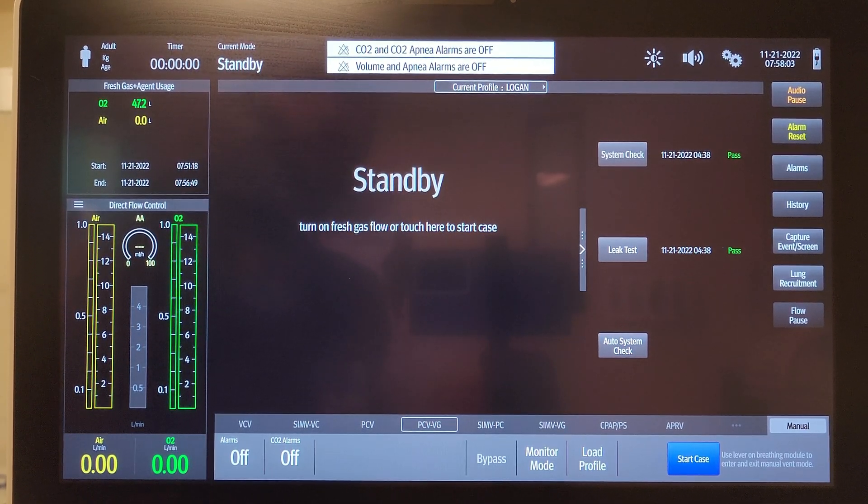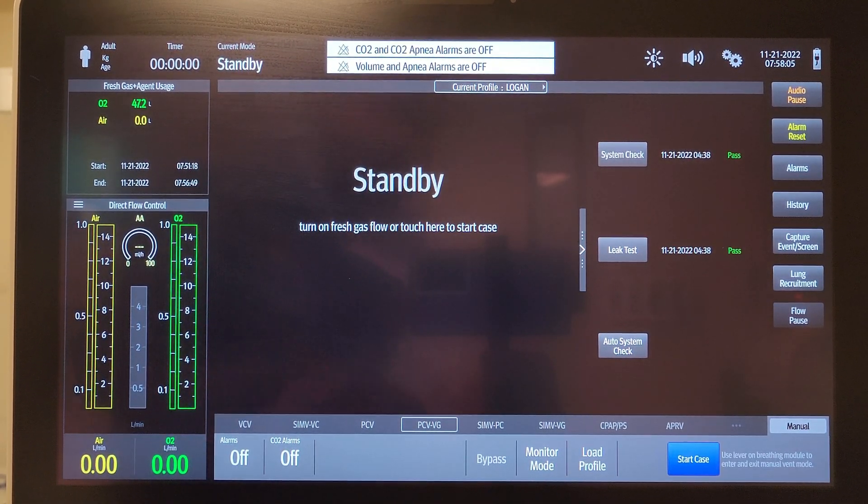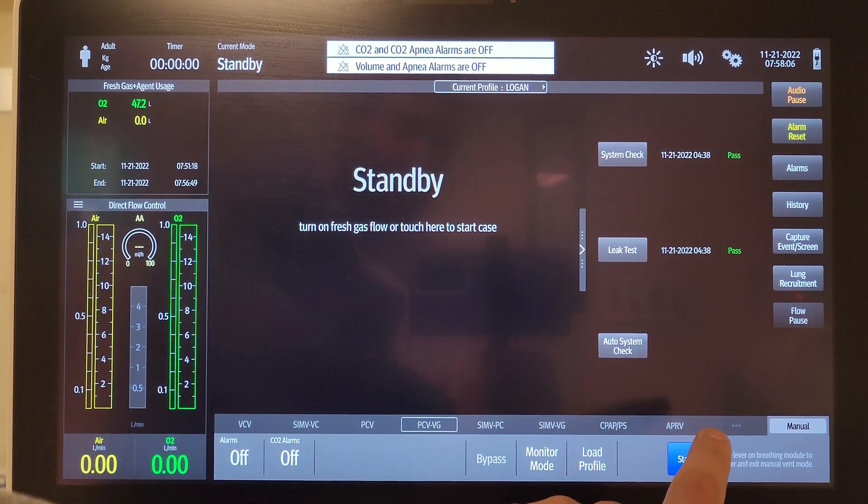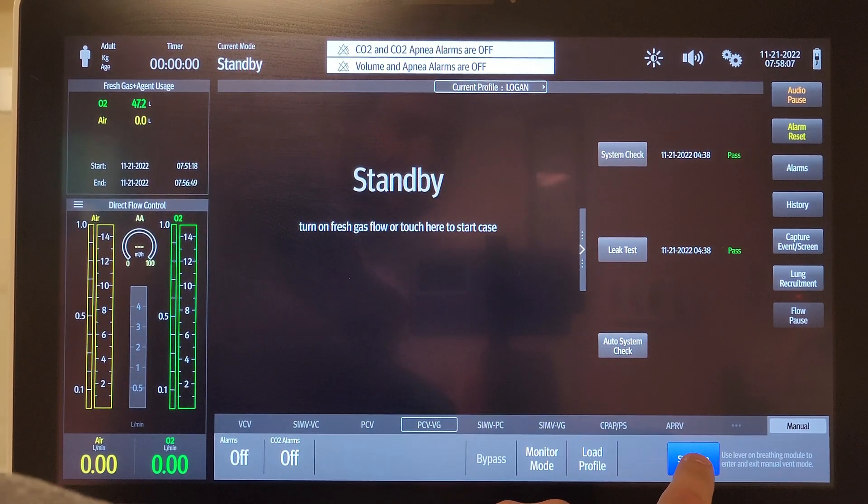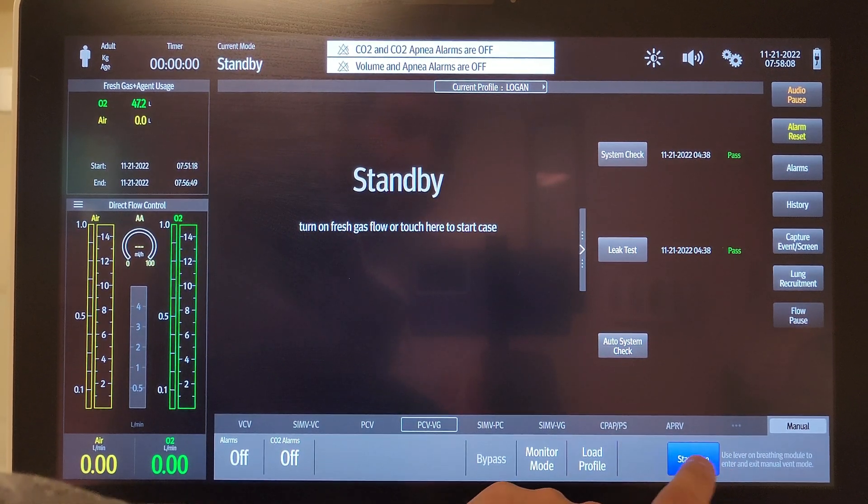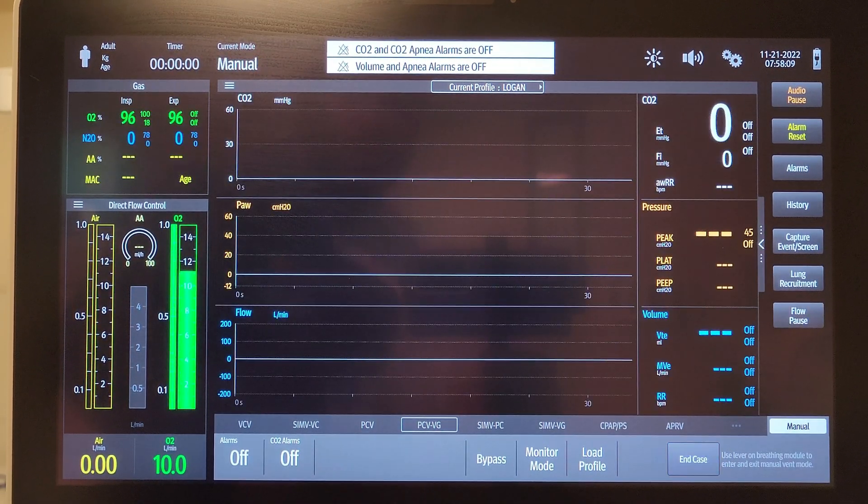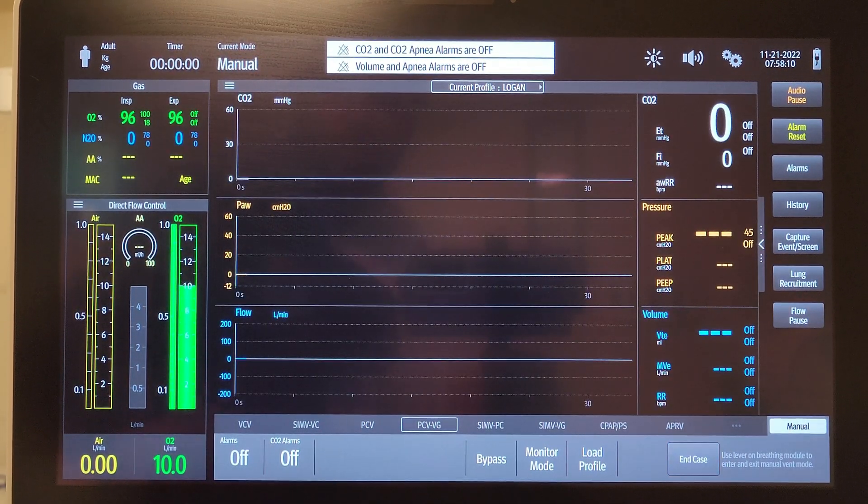Here's how this is going to go. To start a case, there's a start button down here in the corner. You can hit start case and it starts things.